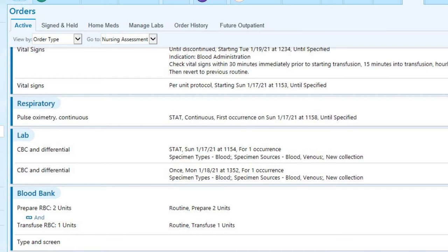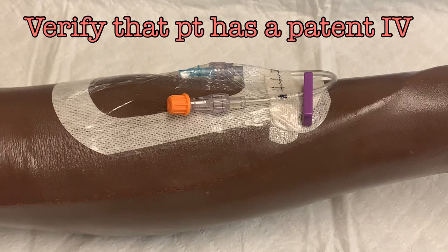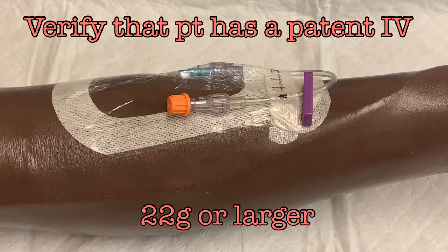If the prepare and transfuse orders are in place, as soon as blood bank has the product available it could be released to the floor. But before you release that blood, there are some tasks that must be completed. Verify your patient's IV access — the patient must have an IV. A 22 gauge is the minimum requirement, but larger gauge IVs will flow more smoothly.